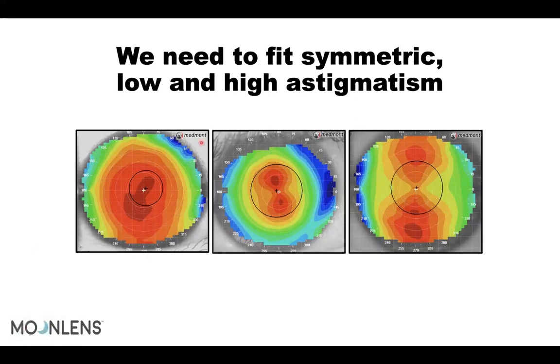So with this one, the thing here is, we have with-the-rule corneal astigmatism, and it's at the very apex of the cornea, right?